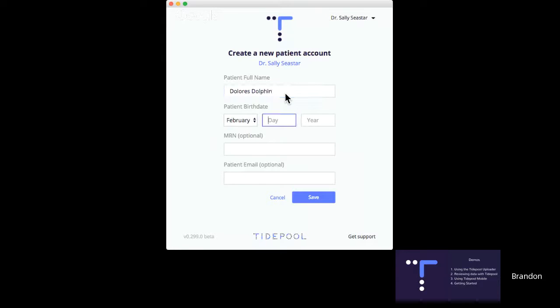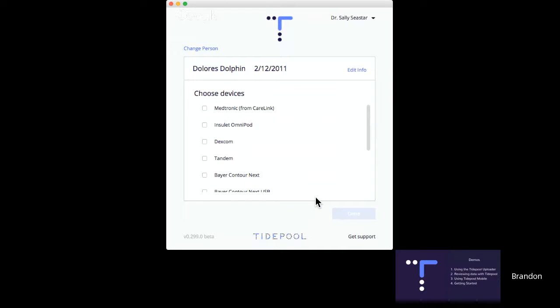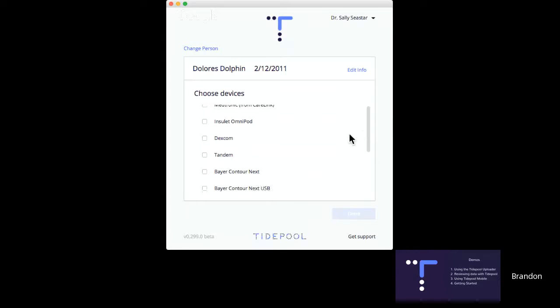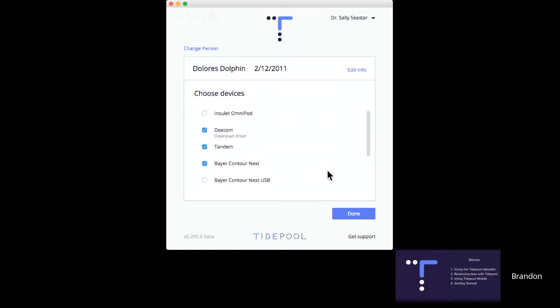Today we're going to add Dolores Dolphin. We can also put in Dolores' medical record number and her email address. The benefit of adding the email address — and this is something we strongly encourage — is that Dolores will then get an email at home inviting her to take ownership of her Tidepool account. That means she can access her data at home, continue to engage with it, and continue to upload her devices from home. Once we've created Dolores' profile, we choose her devices: a Dexcom, a Tandem, and a Bayer Contour Next meter.